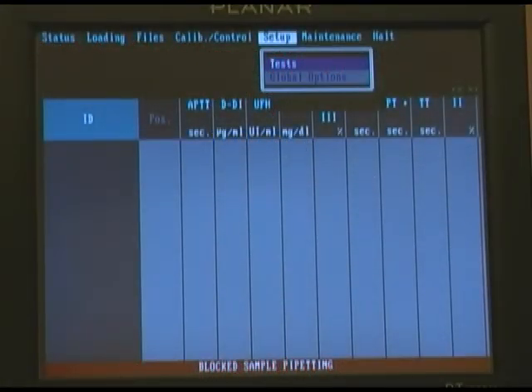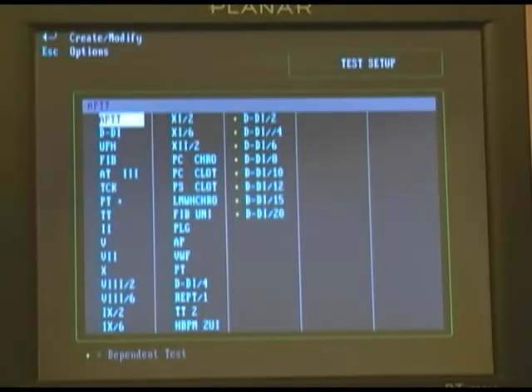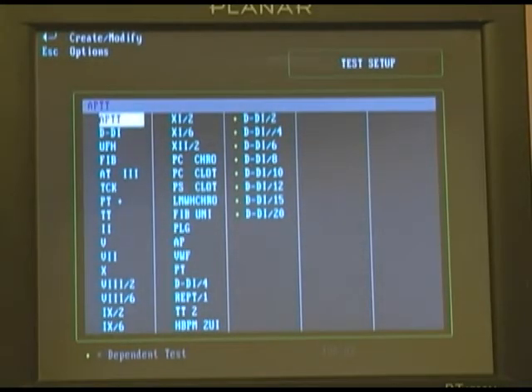The next set of options we want to talk about are under Setup, Tests and Global Options. Let's highlight Tests, and the list of tests that are currently loaded on your system will now appear on the screen.